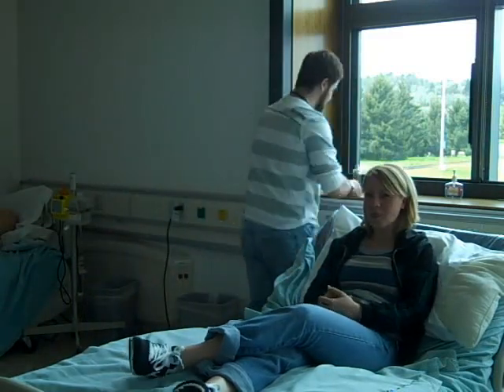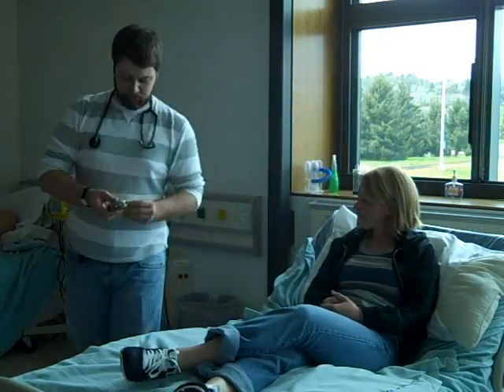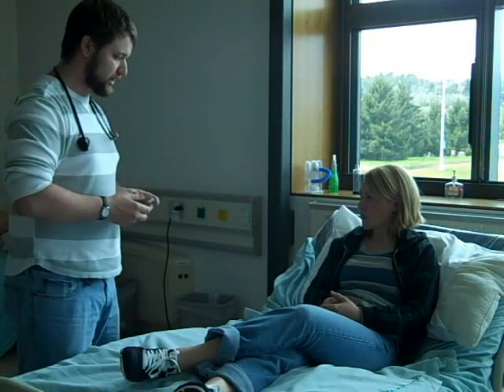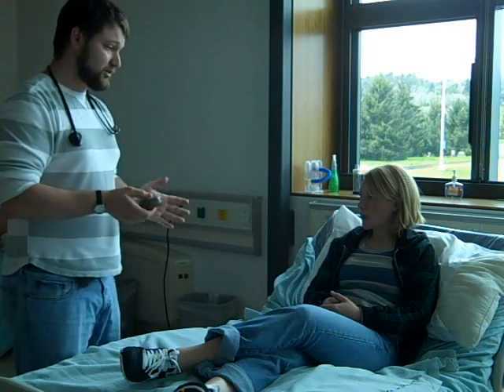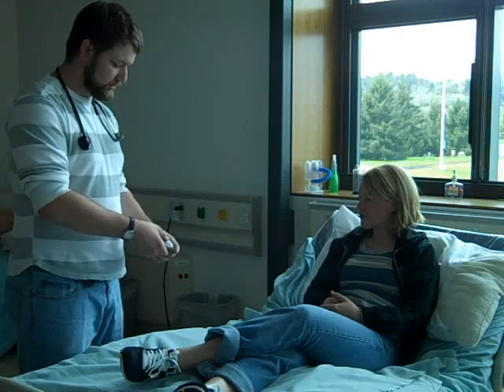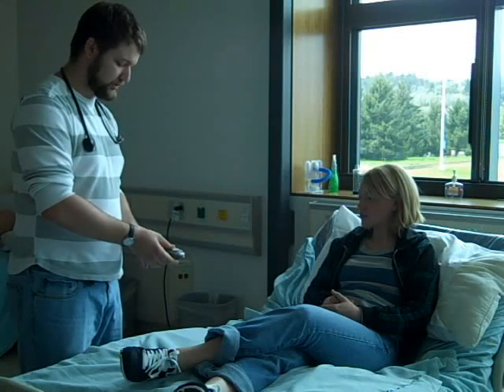So what we've also got is what we call a DPI, which is a dry powder inhaler. This particular one is Advair. And this is actually really simple to use — it's not as hard to use as one of those. As you can see, it kind of just rotates on itself like that.